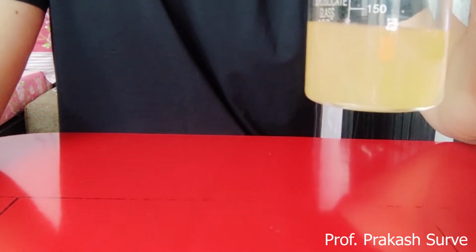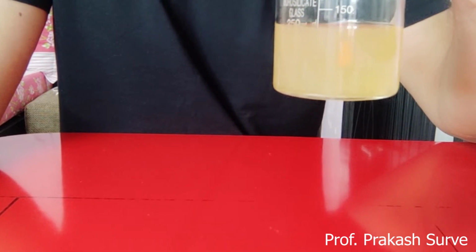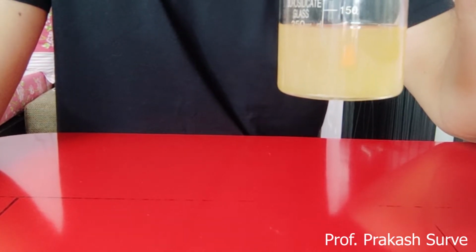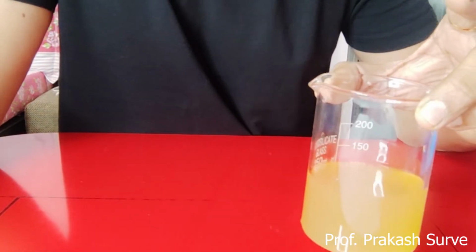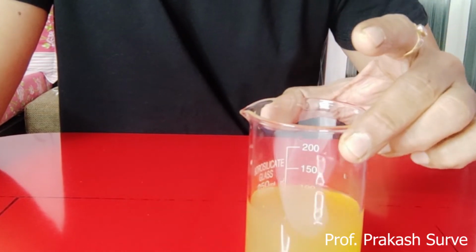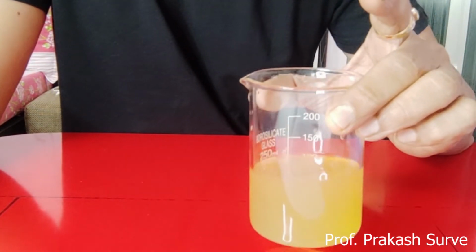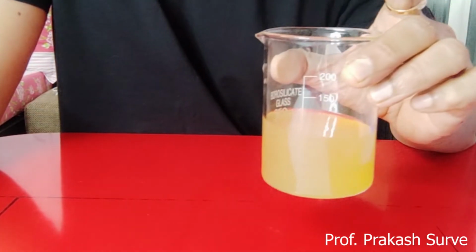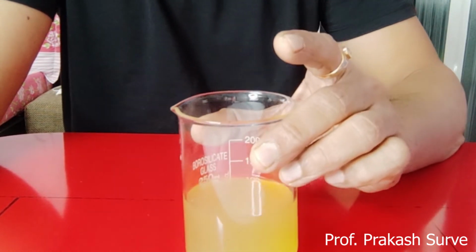This urine contains 95% water and 5% solutes in the form of sodium, potassium, magnesium and ammonia, etc., present in the dissolved state. Many organic compounds are also present, like urea, uric acid, creatinine, etc. In case of abnormal urine, the abnormal constituents we find are sugar, albumin, bile pigments, blood, and pus. If these come in the urine, that urine sample is considered an abnormal one.